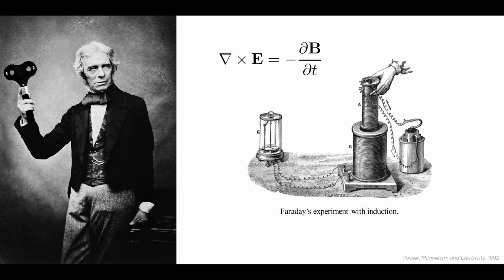The physics of TMS is very simple. It's nothing more than Faraday's law of electromagnetic induction. A time-varying magnetic field is generating a secondary electric field in the brain.